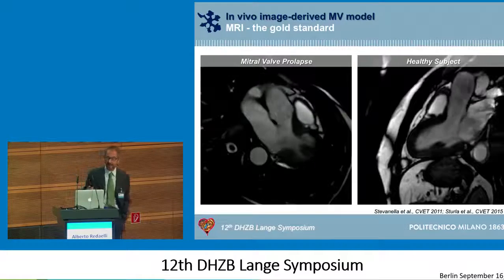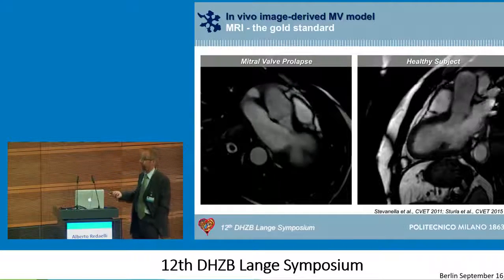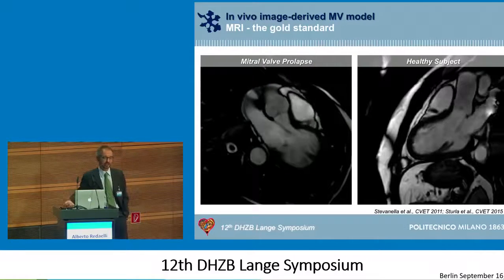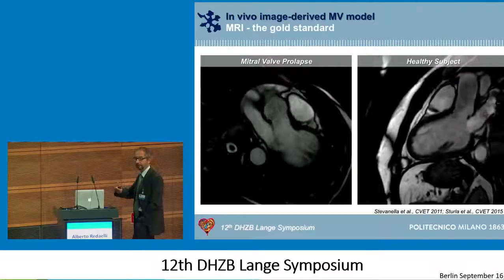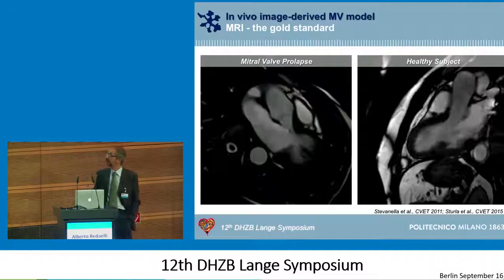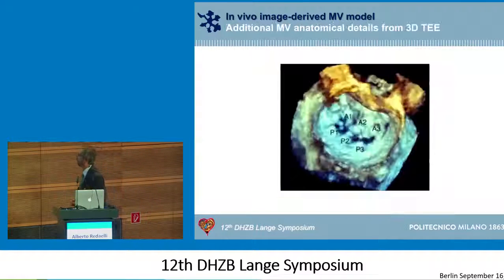On the other side, as I said, unfortunately, we often don't have the MR follow-up of the patients that we study, because the patients don't tolerate this procedure very much, since very often we have a pacemaker implanted in the meanwhile, so they are no longer eligible for this kind of imaging. And so, let's say, we waste half of our patients at least.